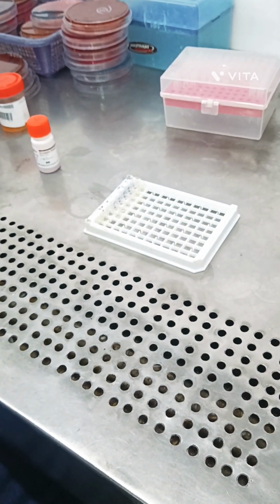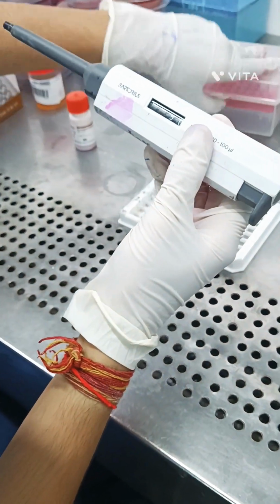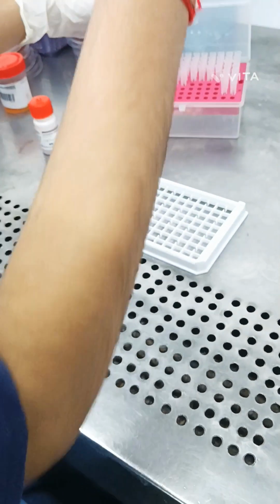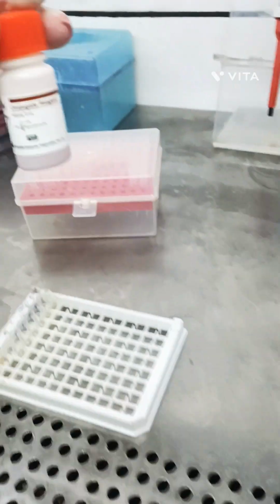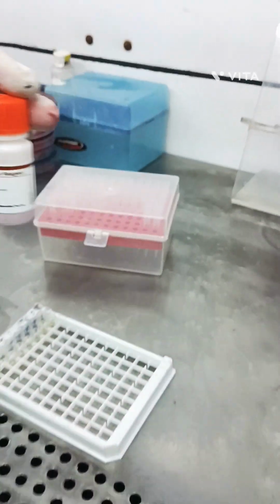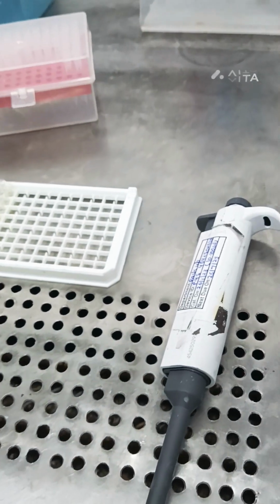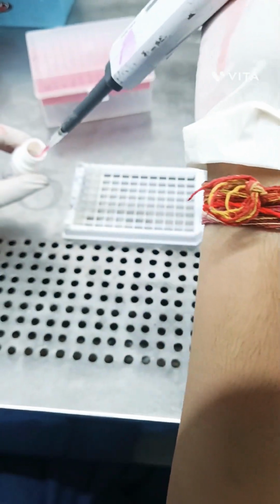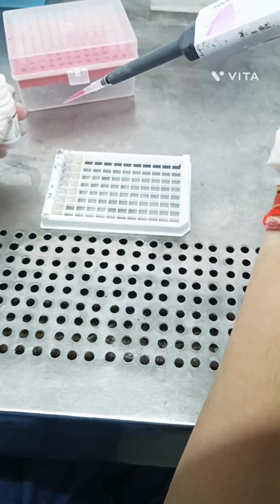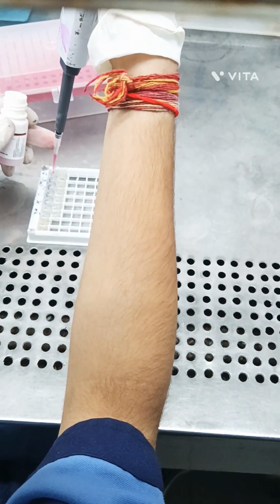So after the 1 hour incubation is done, add 50 microliter HRP conjugate reagent. Yes, this one is the HRP conjugate reagent, and then cover the plate and incubate 60 minutes at 37°.